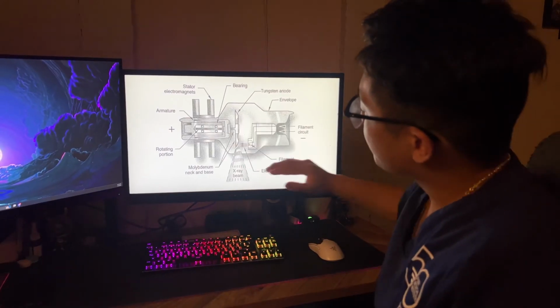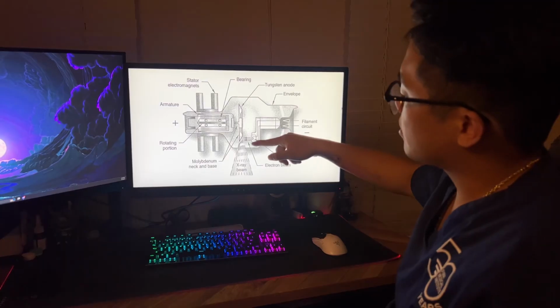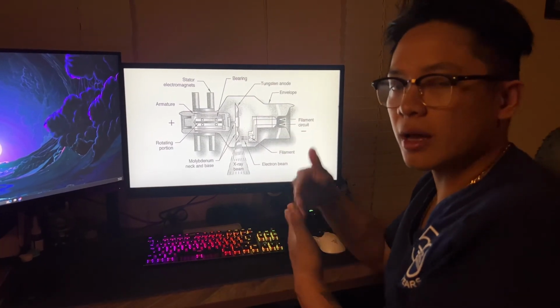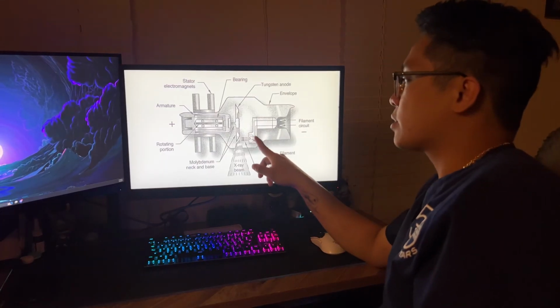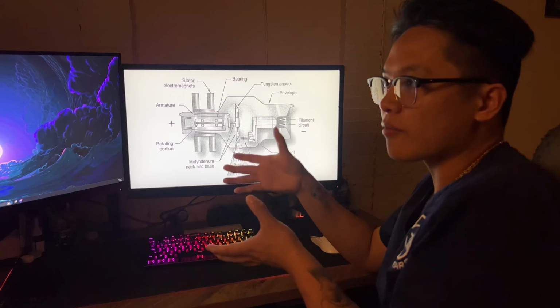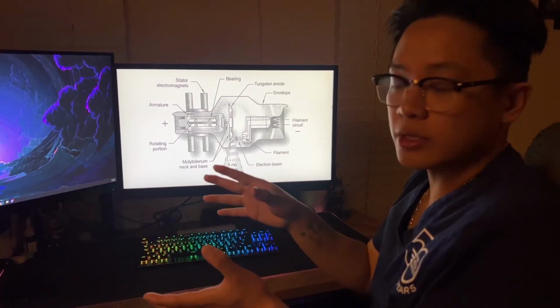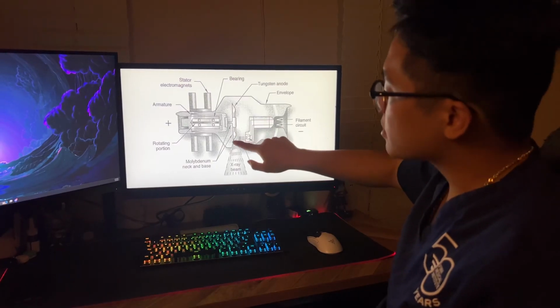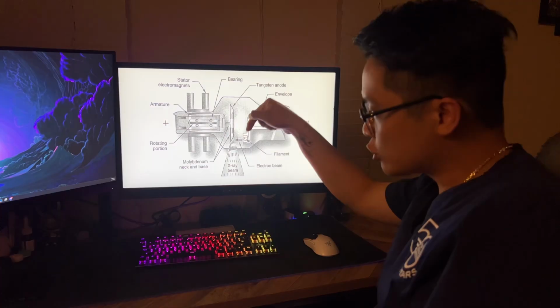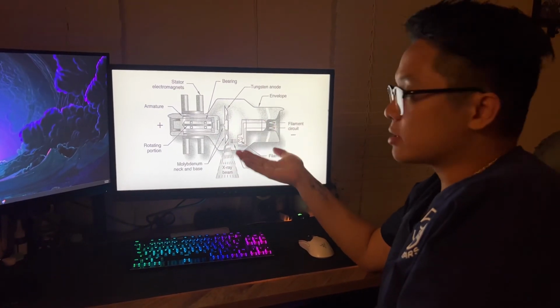So that's moving. The electricity is supplied on the negative side, or the cathode side, goes down the cathode assembly, and a thermionic cloud is made and shot out. The focusing cup keeps it so that not every electron, but most of the electrons, are gathered together. It shoots out, bounces off that ideal angle of 12 degrees of the tungsten anode, and shoots down into whatever is being radiographed as X-ray photons.